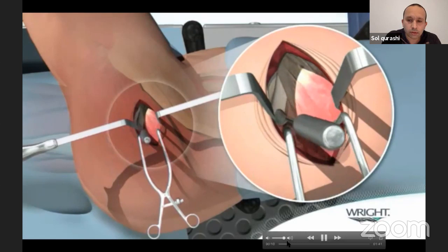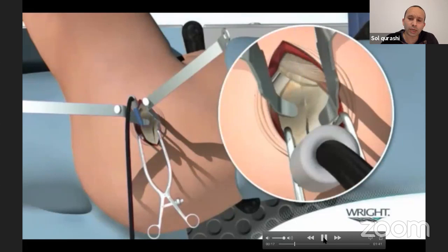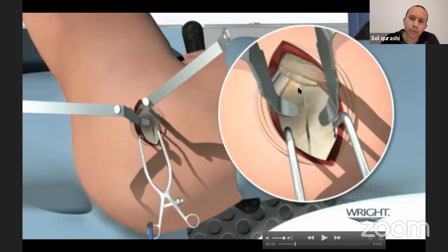Okay, so there's medius rotated anteriorly. Rotators move posteriorly. So then that brings into view your capsule. This is the top of the capsule. You can feel the femoral head through it. And you often place these Homans, as you cut the capsule with a straight line, there's no H or U, just a straight incision going from medial all the way to lateral to the piriformis fossa. And that will get you into the hip joint.